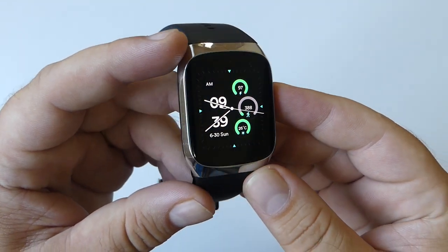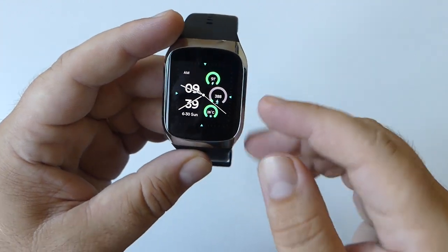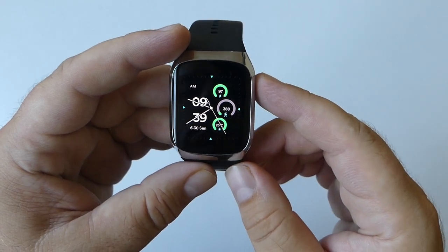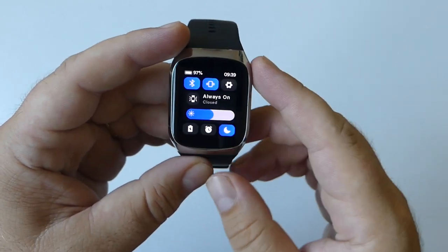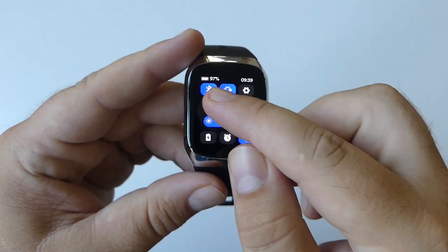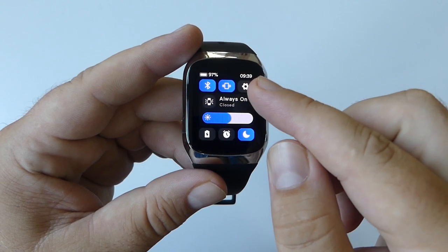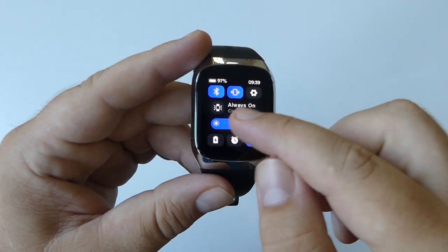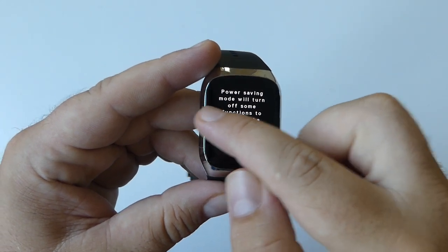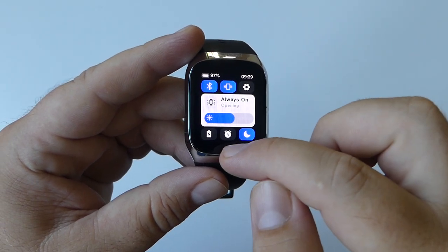Here you'll have access to a watch face which can be changed with the help of the app. Swiping down brings up a quick menu where you have access to Bluetooth, vibration settings, always-on option, battery saver, alarm, and sleep mode.